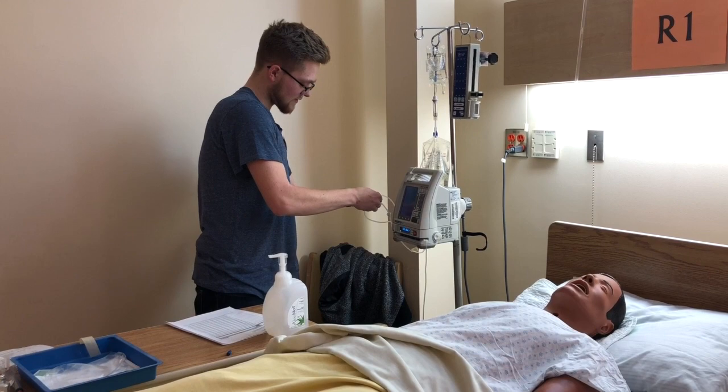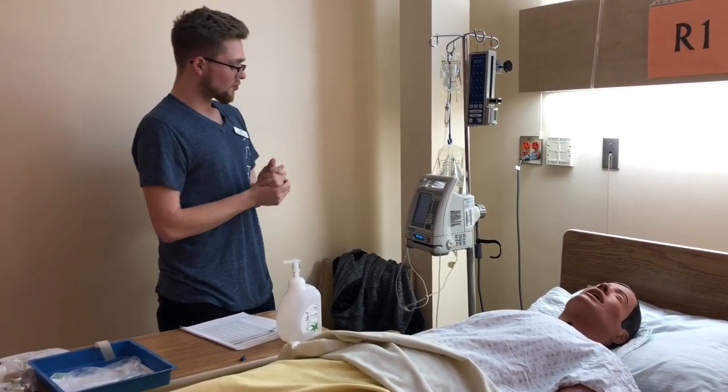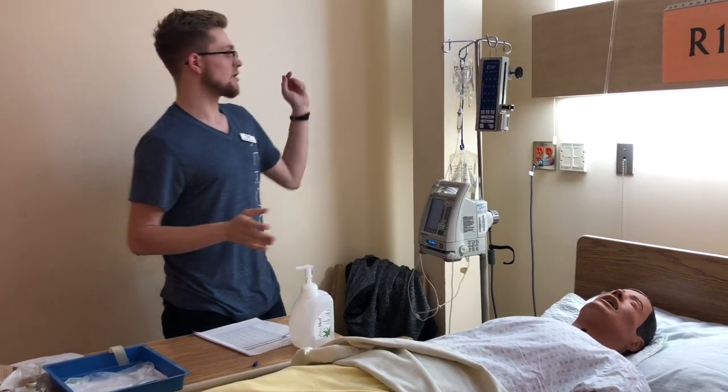So you want to have that there. I'm going to drop that cap. Okay, so this is good now. And so now before we start anything else, we want to make sure that we back prime and get all that air out of the tubing.